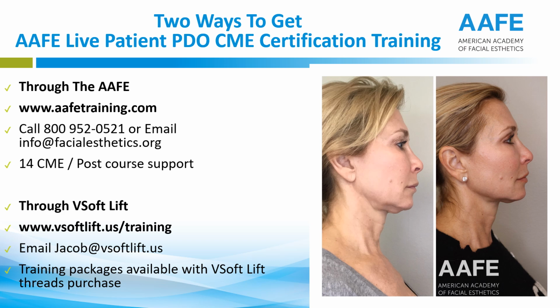Of course, like I mentioned, with the others you may need a lot more threads to do it, but the same techniques will apply. They're the best techniques out there to get the best results, like this one right here, which is lifting PDO threads, as you can see.